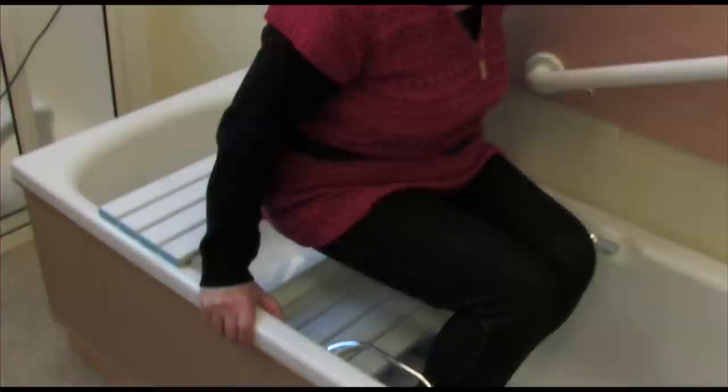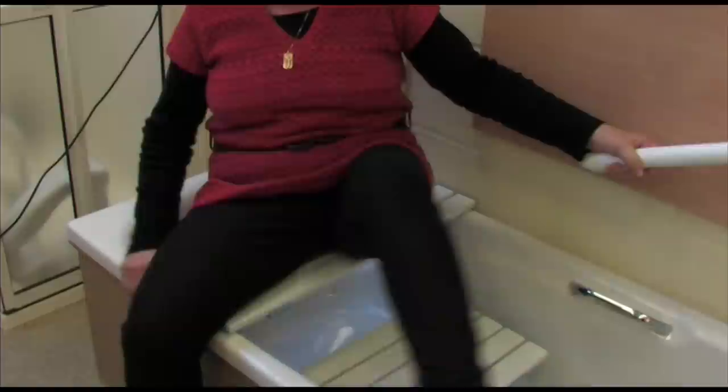To get out of the bath, place your hands on the side of the bath and gently raise yourself from the seat to the centre of the board. Lift one leg out of the bath and then the other.